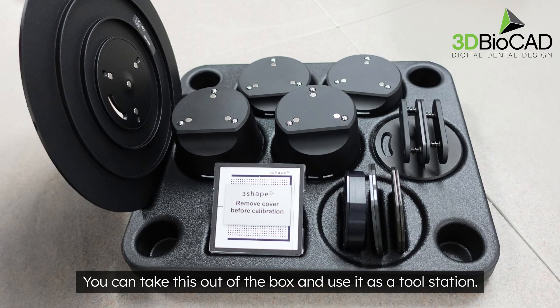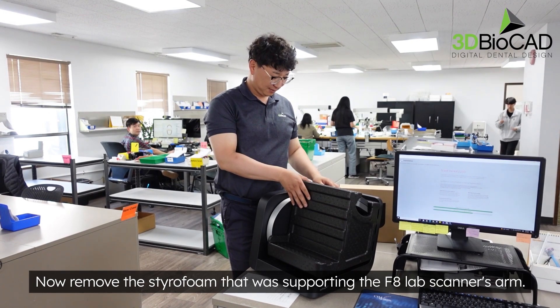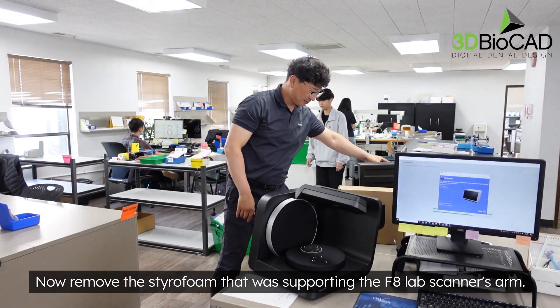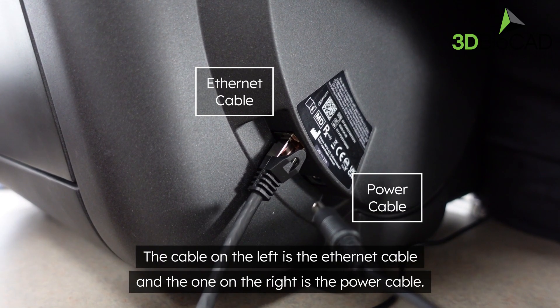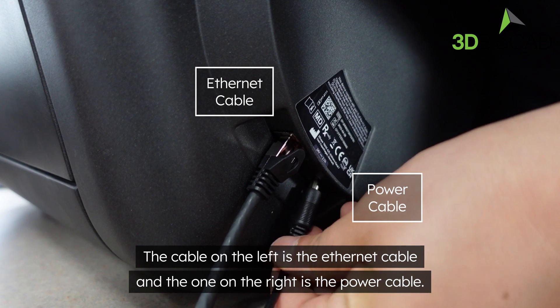You can take this out of the box and use it as a tool station. Now remove the styrofoam that was supporting the F8 lab scanner's arm. Let's connect the ethernet cable and the power cable to the F8. The cable on the left is the ethernet cable and the one on the right is the power cable.